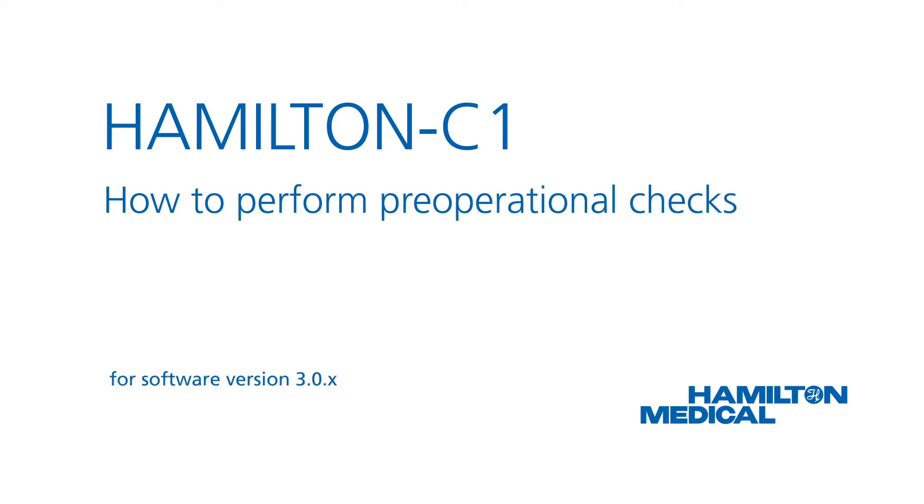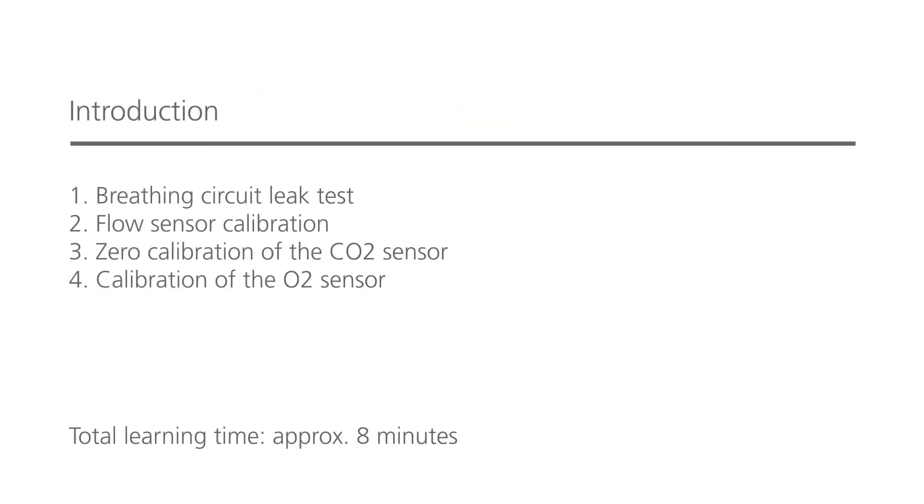This how-to video will show you how to perform the pre-operational checks, including calibration of the flow sensor and a breathing circuit leak test. You'll also learn how to calibrate the O2 sensor and zero calibrate the CO2 sensor if this option is available. Make sure you always do the pre-operational checks before connecting a new patient to the ventilator and after you've connected a new breathing circuit or any other new component. You should be able to complete this whole module in less than 8 minutes.